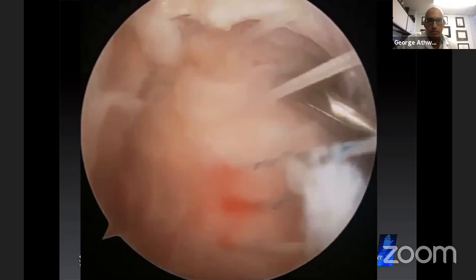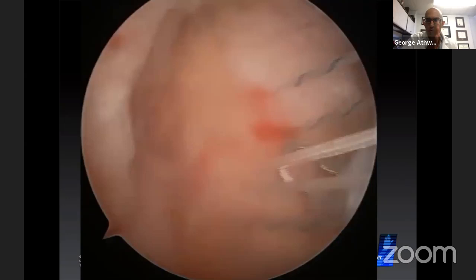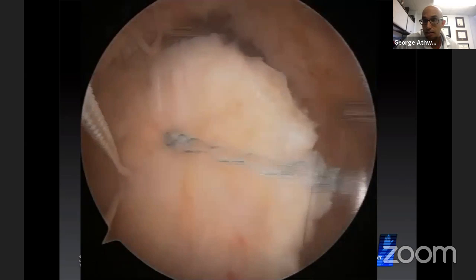So 1, 2, 3, 4, 5, 6, 7, 8. So I got all my sutures on that medial row. And now I'll go ahead and tie my medial row. It's not necessary to tie if you're gonna do a transosseous equivalent. I'm still old fashioned and like to put a few knots in them.